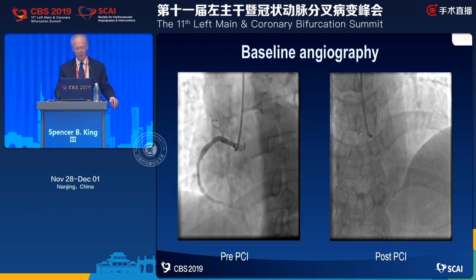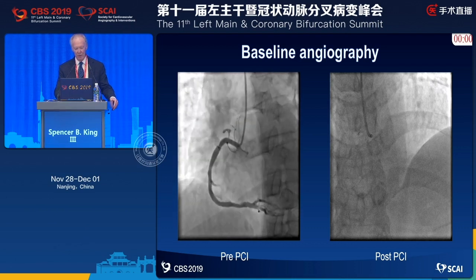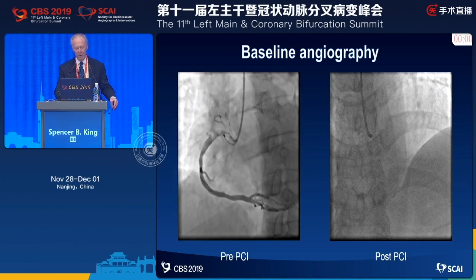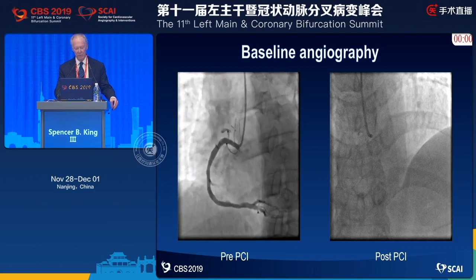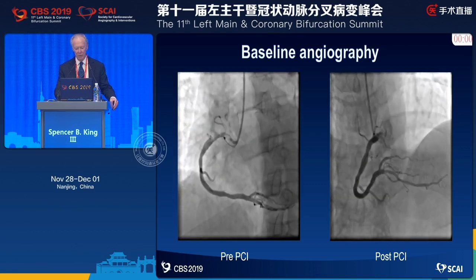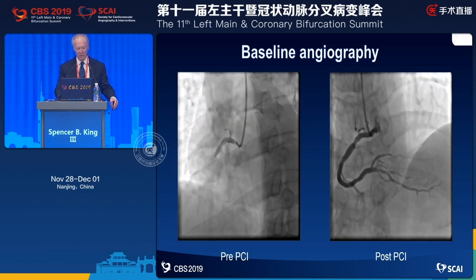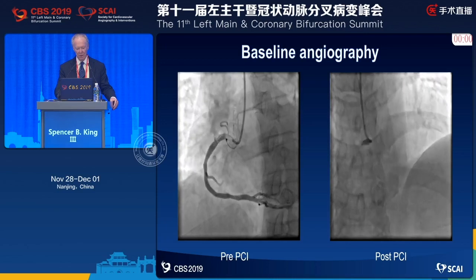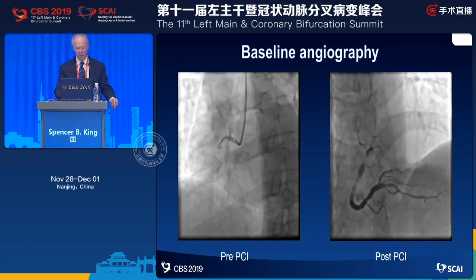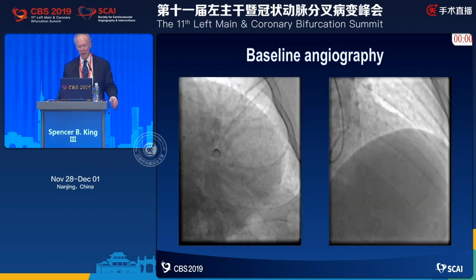Okay, here's an angiogram. And so the chest pain, okay, this says pre-PCI. So following that 8 hours of chest pain, apparently there was an intervention. And that's the right coronary, and this says post-PCI. So I'm assuming that an intervention was made. Can anyone see where the intervention was made? Okay, we don't have a clear understanding.